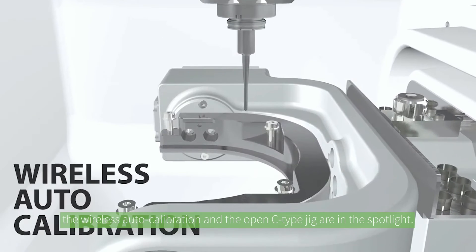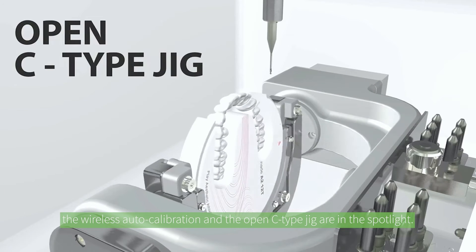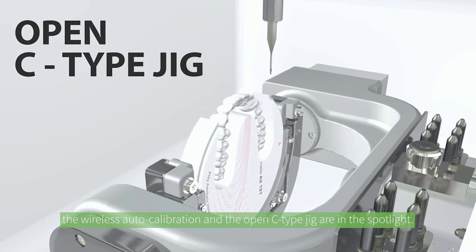Brace yourselves. The wireless auto-calibration and the open C-type jig are in the spotlight. These dynamic features streamline workflows, enabling labial side and undercut zone milling.